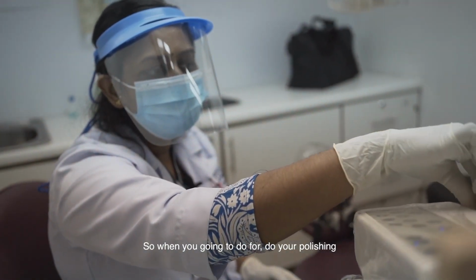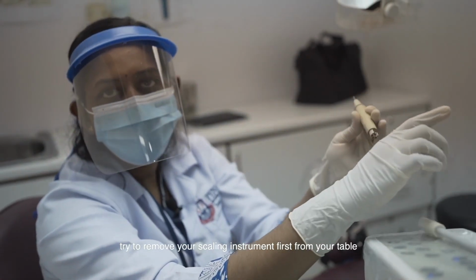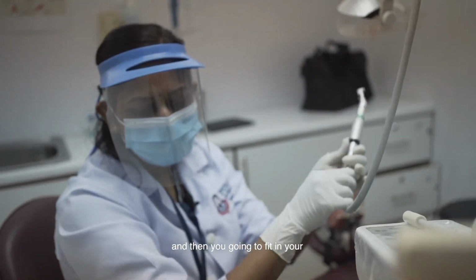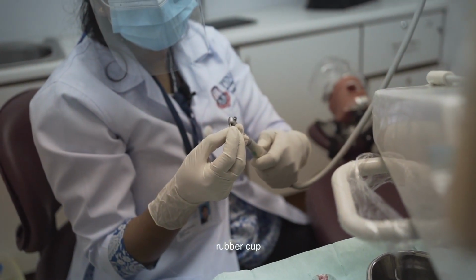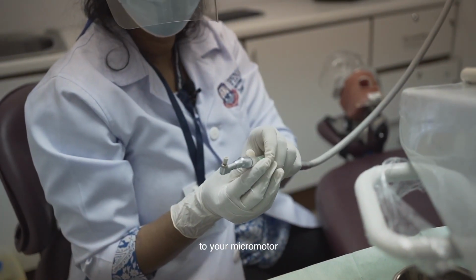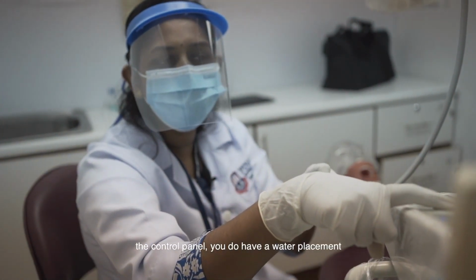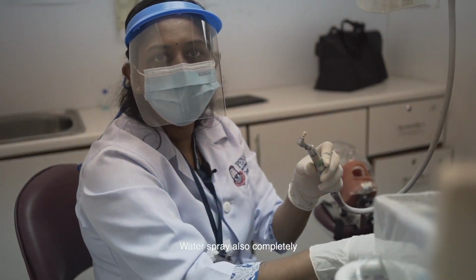So when you are going to do your polishing, try to remove your scaling instrument first from your table, because there are chances that you get injured with this particular equipment, and then you fit your rubber cup to your micromotor. And while you are doing that, try to close the water in the control panel. You do have a water placement. Try to close that and try to close the water spray also completely.